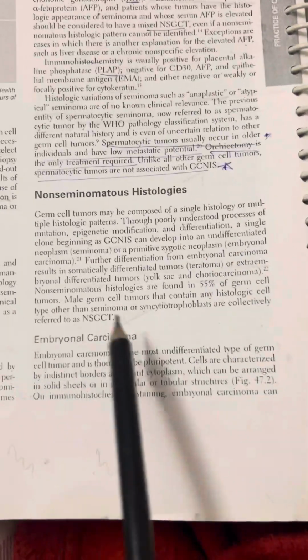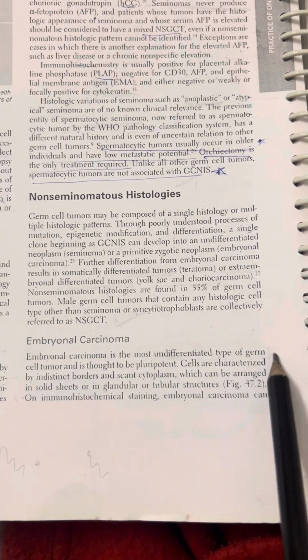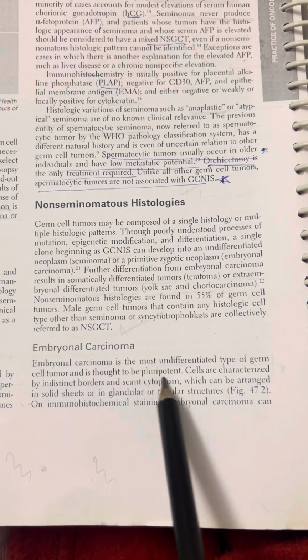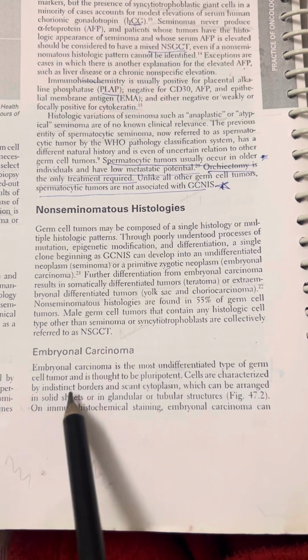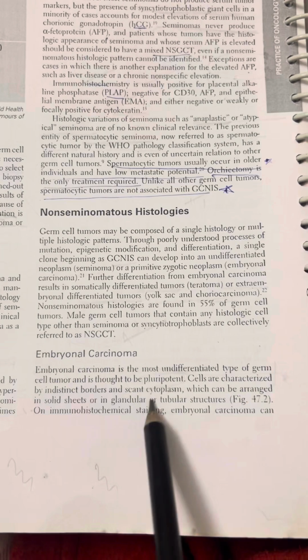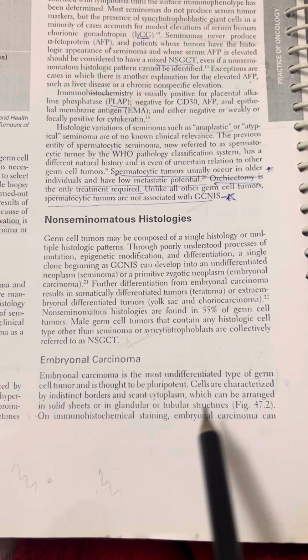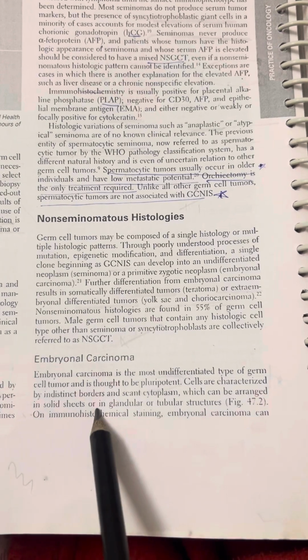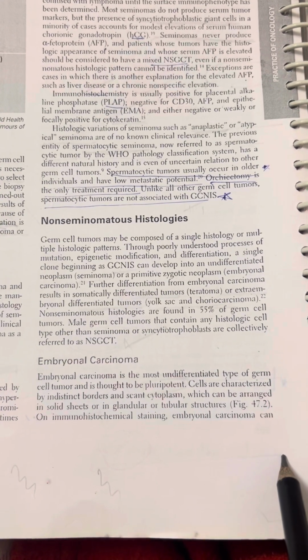So first we will see embryonal carcinoma. Embryonal carcinoma is the most undifferentiated type of germ cell tumor and is thought to be pluripotent. The cells are characterized by indistinct borders and scant cytoplasm, arranged in solid sheets or in a glandular tubular structure.